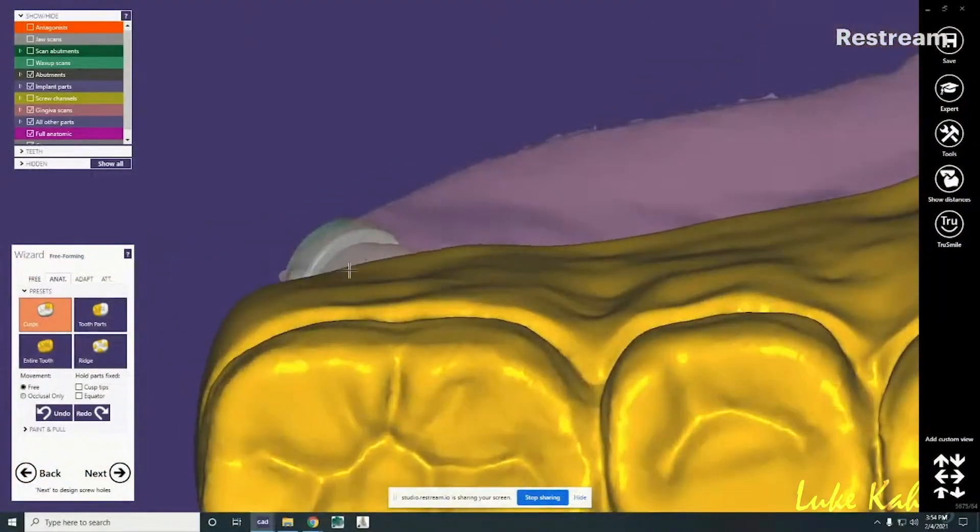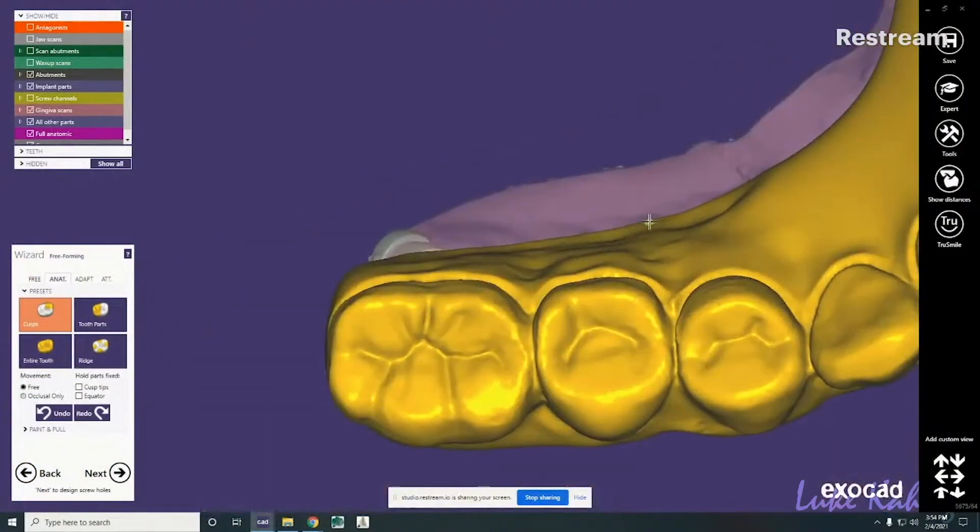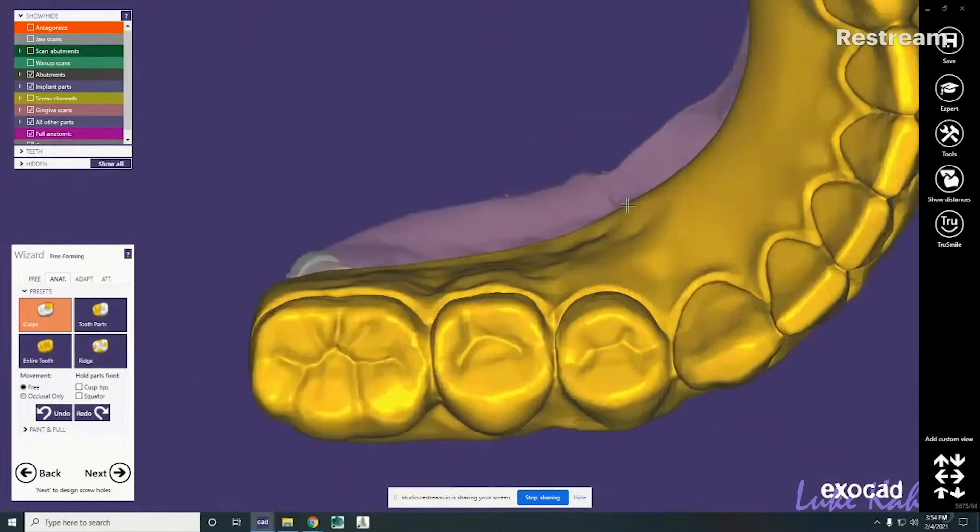First, we design the zirconia arch in ExoCAD, based on information provided to us by the doctor.